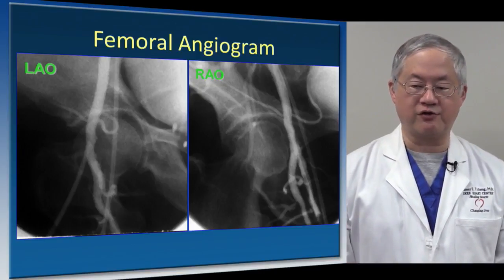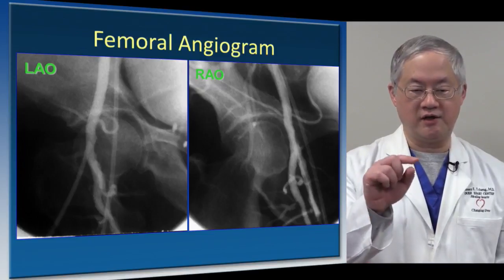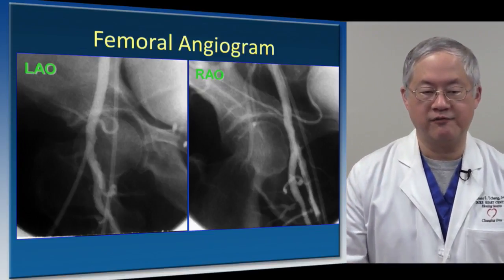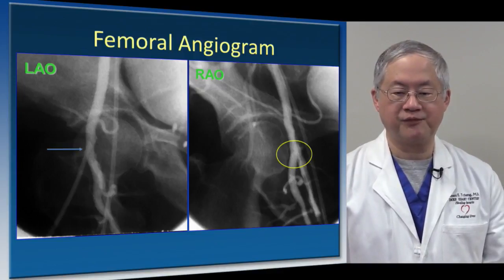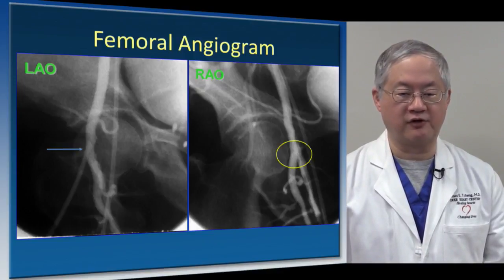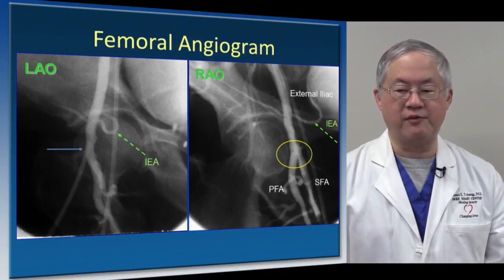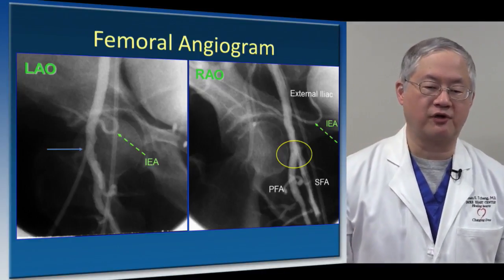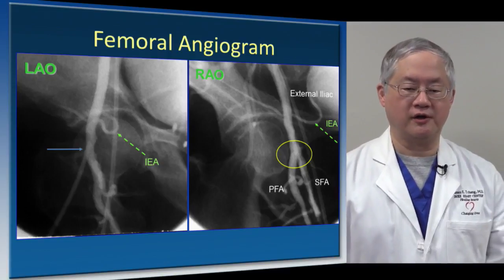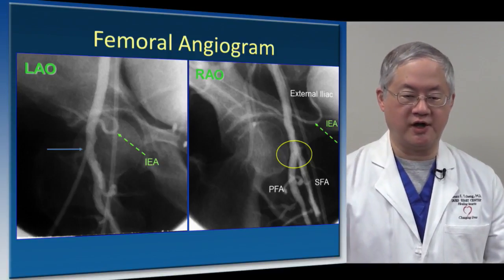This is a femoral angiogram to demonstrate a relatively high stick, but you can also see by hitting that midpoint at the femoral head that you basically have avoided the profunda in establishing vascular access. The other thing that you need to remember is that there is one other structure that defines the upper bounds of where you want to strike, and that's the inferior epigastric artery, the IEA.